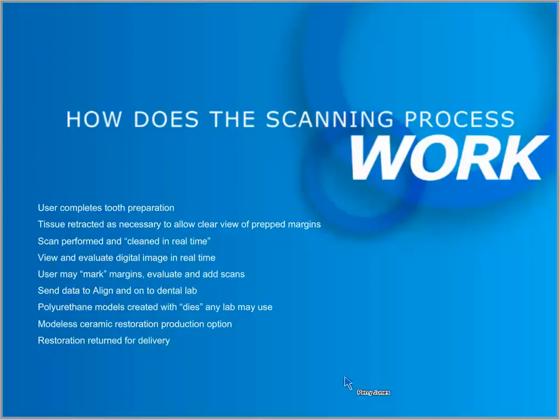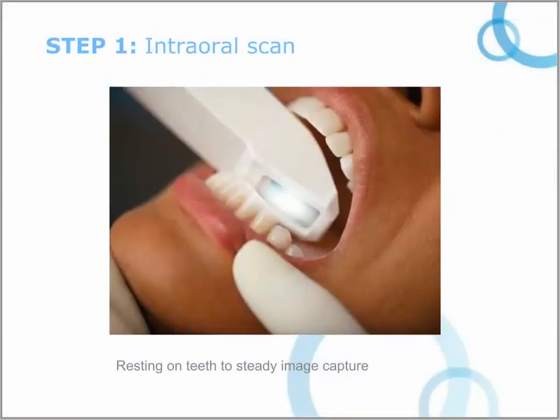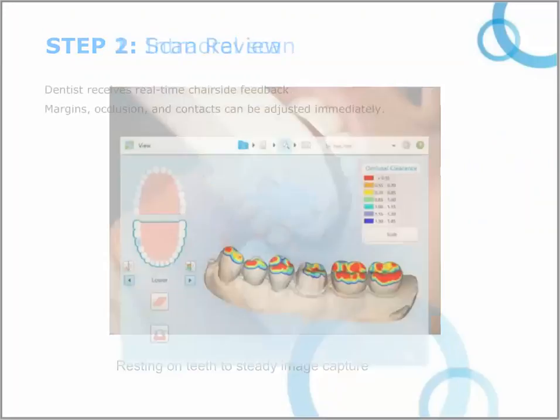You can also work in a modelless world with ceramic restorations or zirconia restorations as an all-digital workflow. The restoration is then returned for delivery. So let's follow through that with some pictures. Here we have our digital scan. This is our iTero scanner, again resting on the teeth, with the ability to capture a steady image.